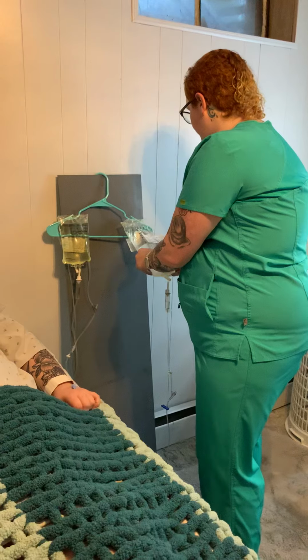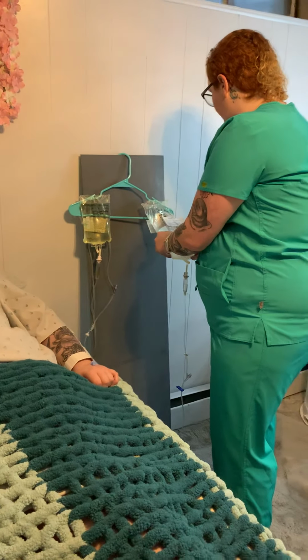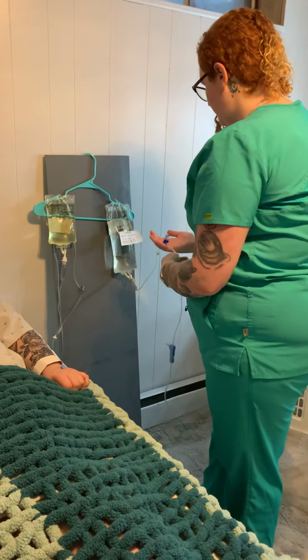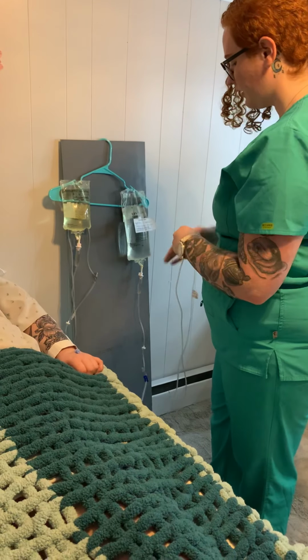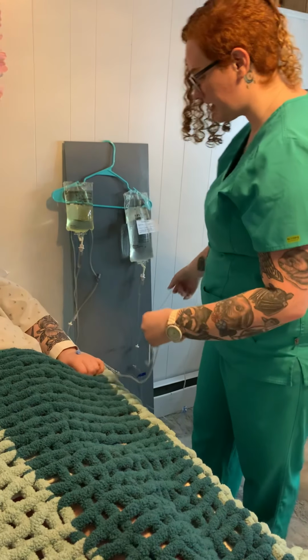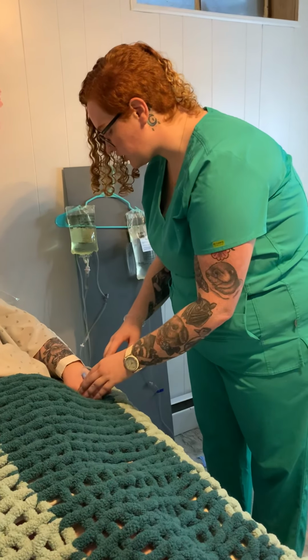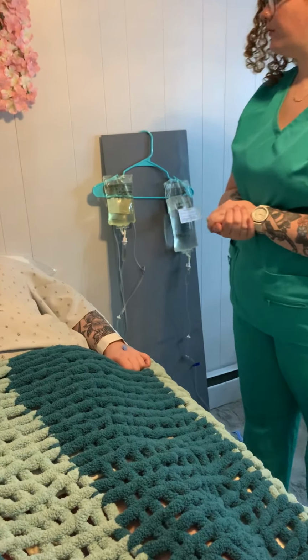0.9% sodium chloride running at 125 mL per hour with phenytoin 100 milligrams added to the solution. I will inspect the tubing for any kinks or air bubbles that may be there, and assess the IV site for any redness, drainage, infiltration, or tenderness upon palpation. Alright, I will be back when I have all my supplies.